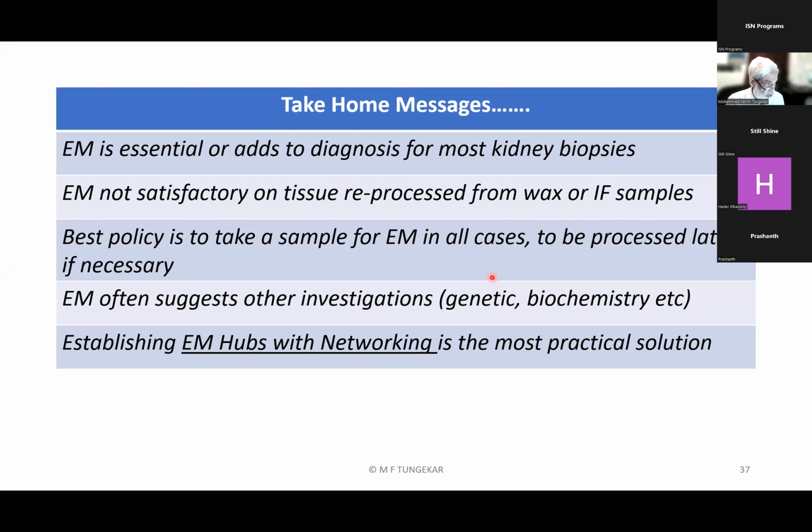IF sample is frozen, and then you stain for various immunoglobulins and complement. You process them for EM, not satisfactory. Best policy is to take the EM in all cases, as I said again and again. EM often suggests other investigation. It makes it easier to select other investigation. And of course, establishing EM hubs and networking is the most practical solution.